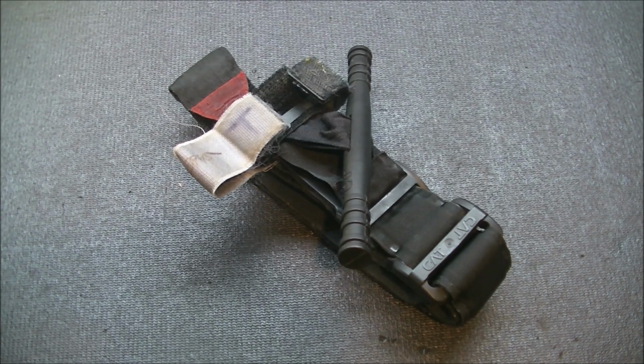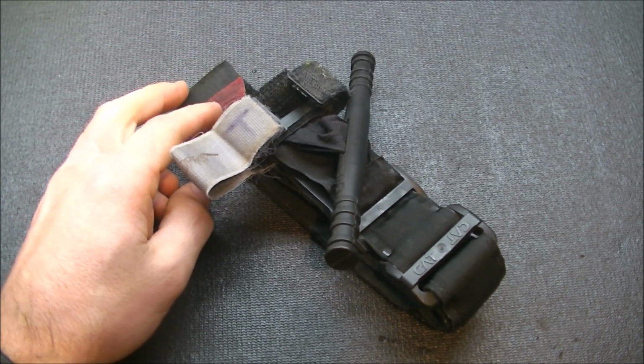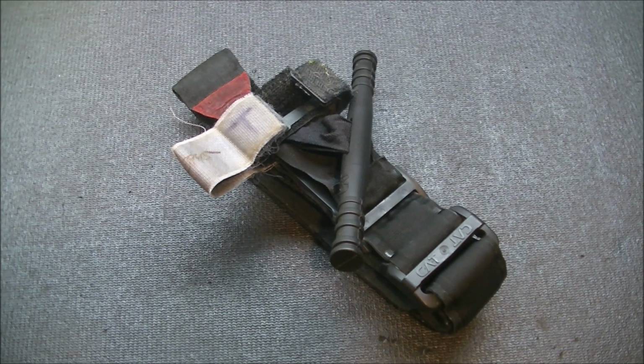And also, this is a Velcro-only system, so that Velcro has to defeat issues like blood, dirt, sand, whatever condition it's in. So again, when I said it's an advantage that there are multiple carriers, this system actually needs it to protect the Velcro, because this is the primary system that's holding it all together. When you tighten the tourniquet around a limb, that's really where you make your money, is the tightening of it. So you've got to make sure that Velcro is secure and that there's enough Velcro to grip.